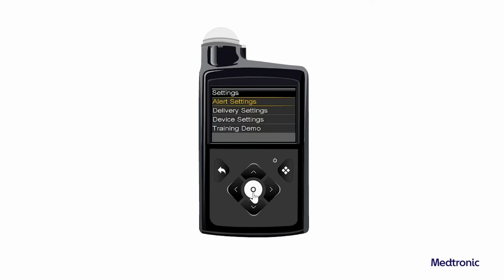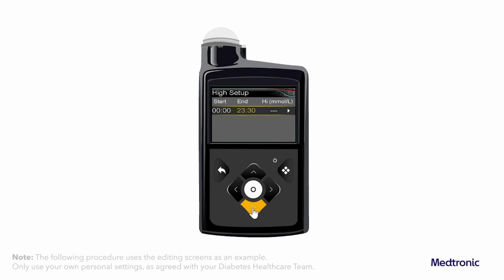Select Alert Settings and then select High Alert. The high setup screen appears. Select the time segment. The end time flashes. The start time of the first time segment is always midnight.